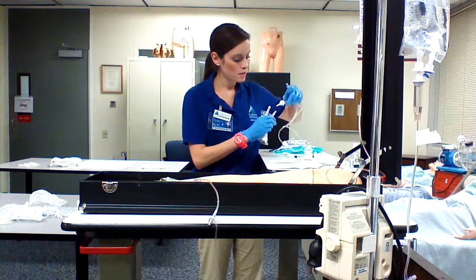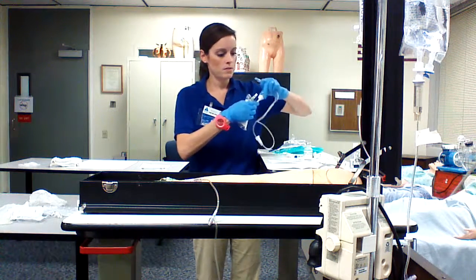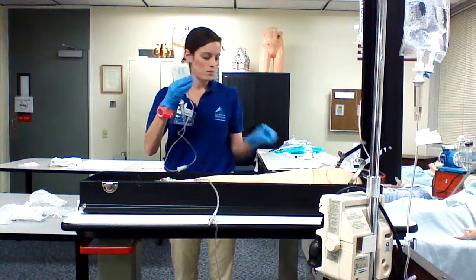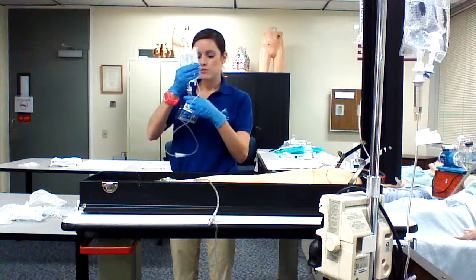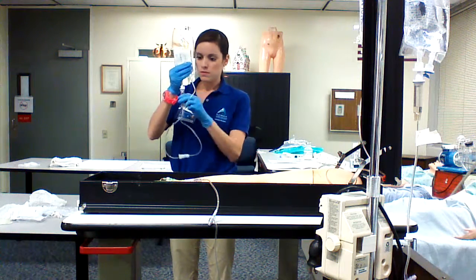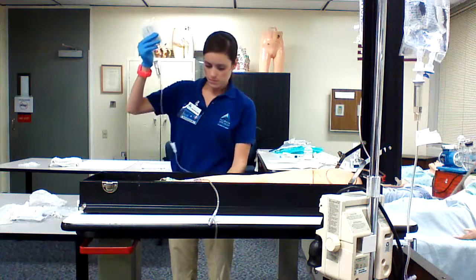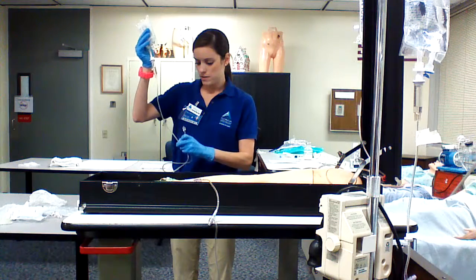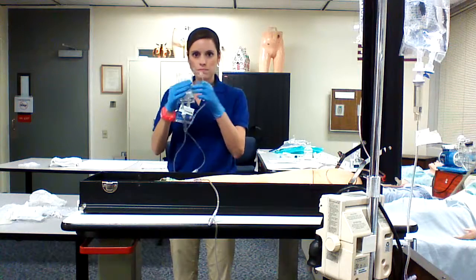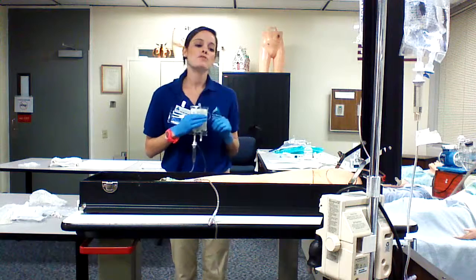Also, again, maintaining aseptic technique. So I'm going to prime my tubing, prime the chamber about halfway. Allow for it to flow, and there we go. It's primed. Okay. And I have that. All right, Mrs. Jones.